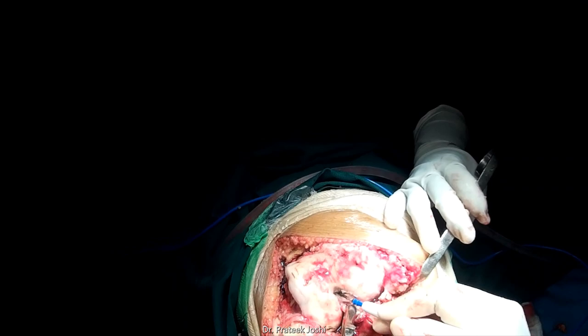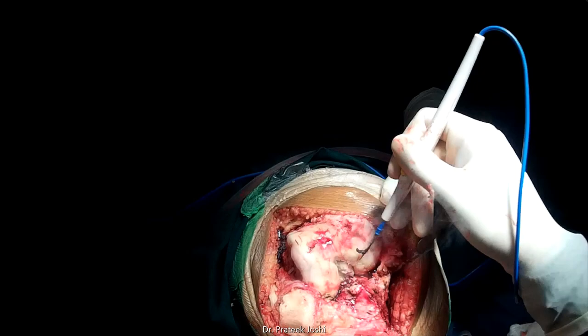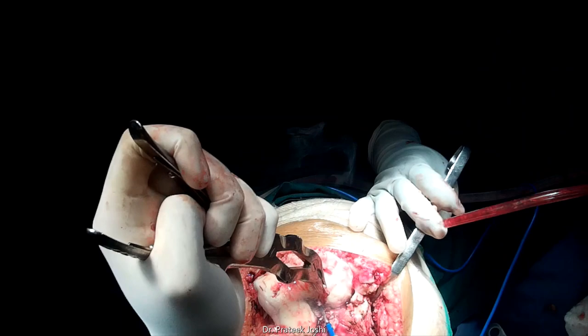Now we flex the knee while keeping the patella everted and excise the anterior and posterior cruciate ligament and both the menisci so that we have a clear view of femoral condyle.